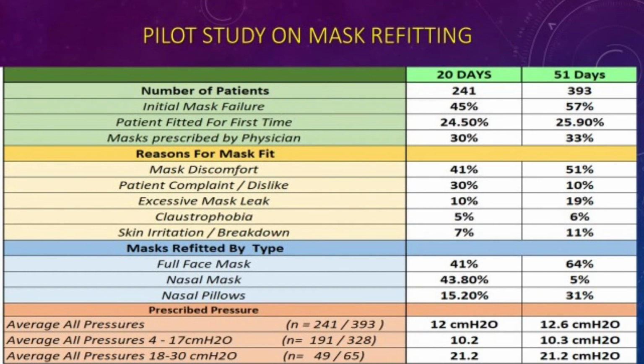Overall, again, this was a pilot study. We were just kind of peeking at what was out there. We had plans to redo this study and make it more specific, with more detail. Unfortunately, we never had a chance to go back and review the data and conduct another study, so this is where it came to. But probably of more value to you is the surprising thing with mask discomfort, 51%. I thought other factors would be much larger, but this turned out to be the biggest factor for patients wanting to come in for a mask refit. So please note that for your future mask fits.